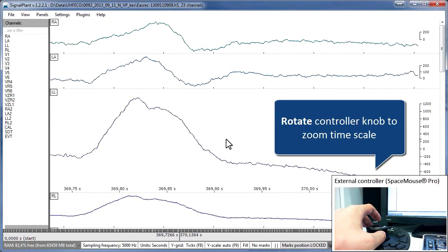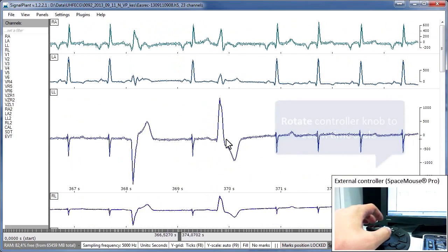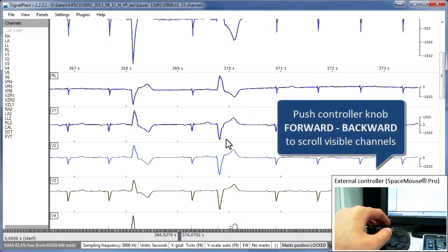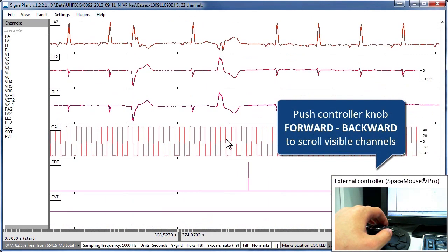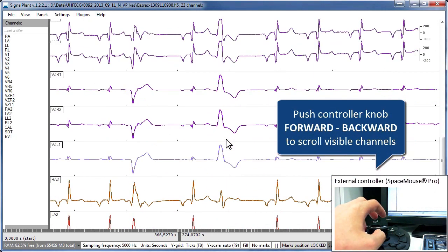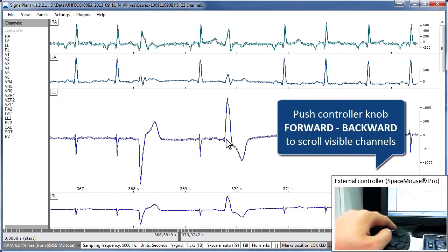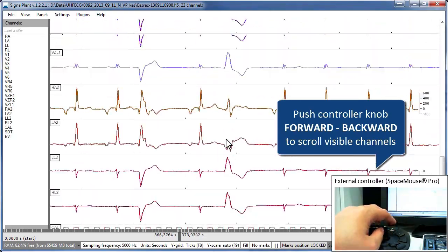What's really helpful is the ability to vertically scroll displayed graphs. Just push the knob forward or backward.